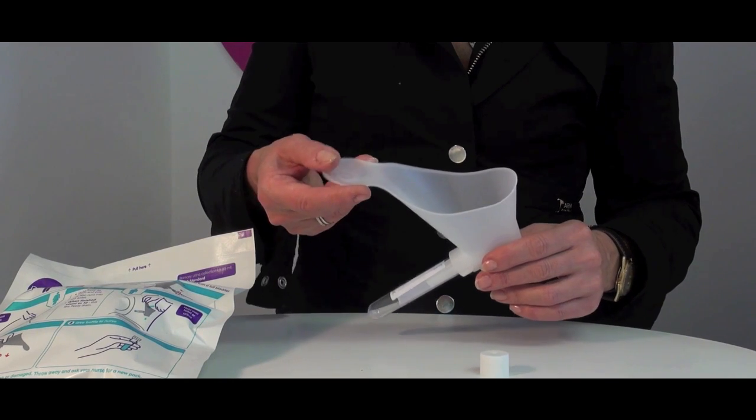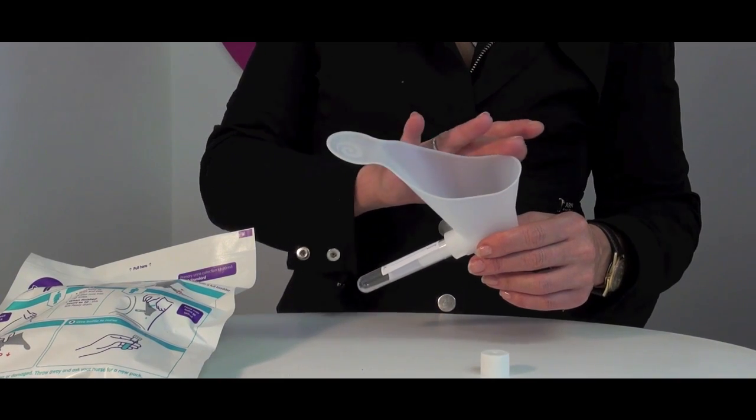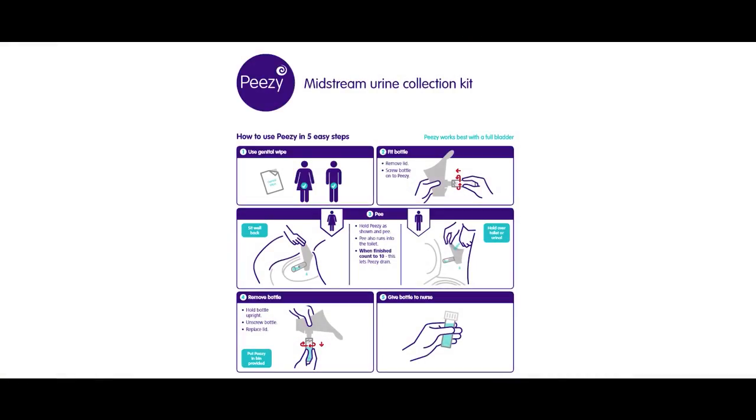Here you can see that PZ has a nice wide handle and a soft rim around the top, so that women can comfortably hold it against the body. Men hold it over the toilet because the first flush is rejected into the loo below.